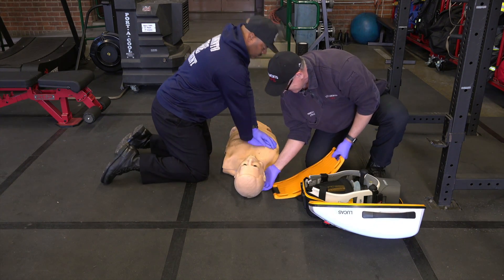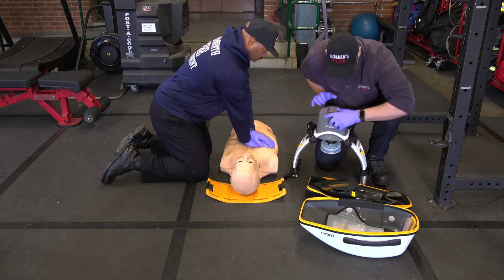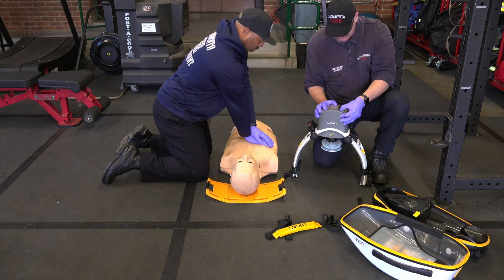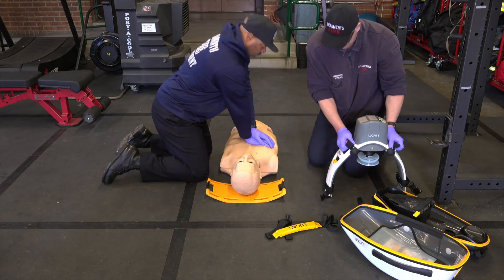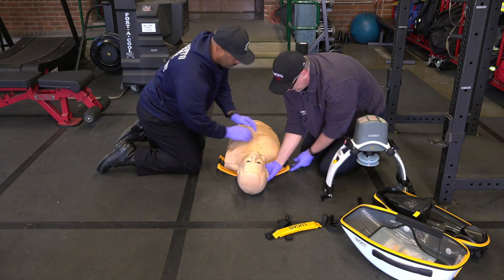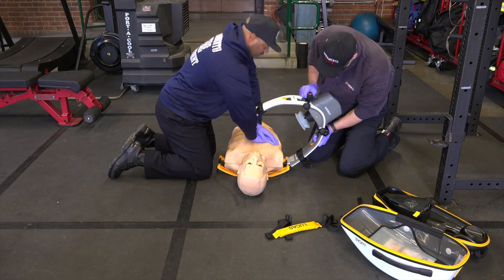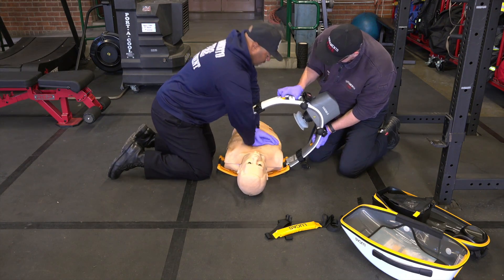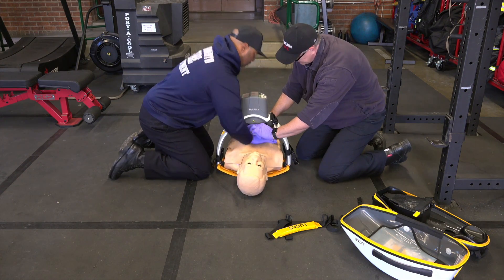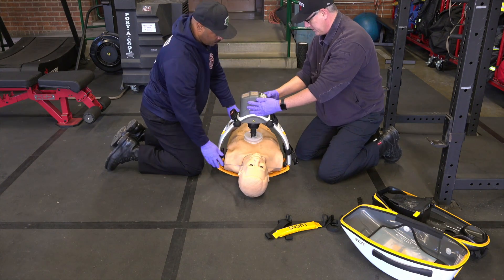CPR has started. You can see the backboard is already unpacked and placed behind the patient's head. He's pulled the Lucas device out, accessed the shoulder strap, and is activating the device. Coordinating together, they lift the patient, slide the board into place, resume CPR, attach the device using the trigger, coming through his arms, reattaching on the other side, and hearing those clicks.